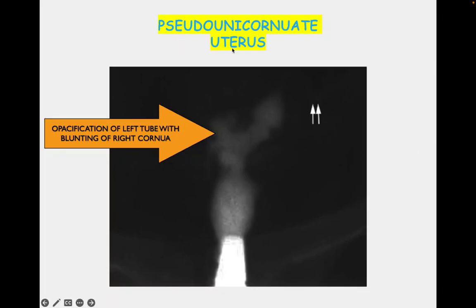There is a condition known as pseudo-unicornuate uterus. The actual unicornuate uterus looks like a banana with one patent tube. However, if opacification of only one side occurs — as seen here with opacification of the left tube and blunting of the right corner — it gives an appearance of a unicornuate uterus when it actually is not, due to scarring of the uterine cavity.